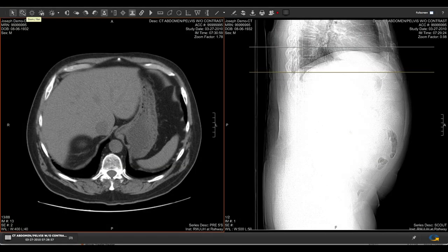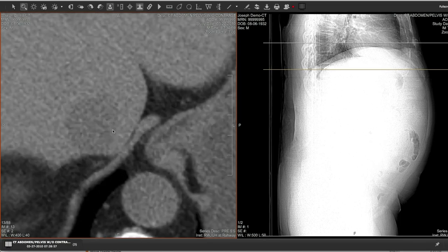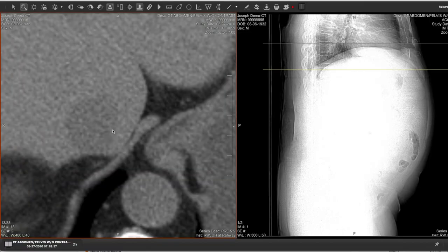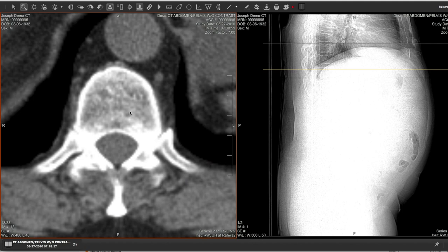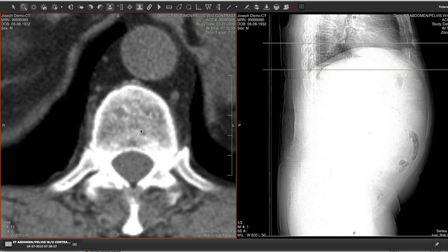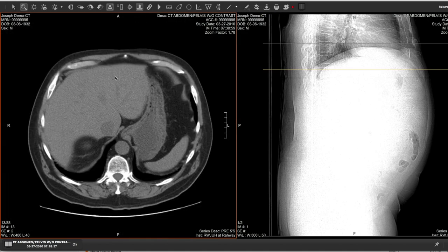To zoom in and pan around an image, select the Zoom tool. Zoom in and out using your mouse or keypad just like scrolling. Once you have zoomed to the desired level, click and hold while moving the mouse to pan the image. Click on the Revert to Original icon anytime you want to restore the original image display state.